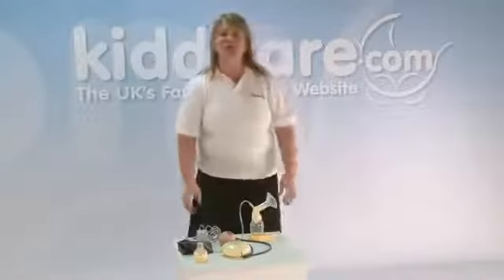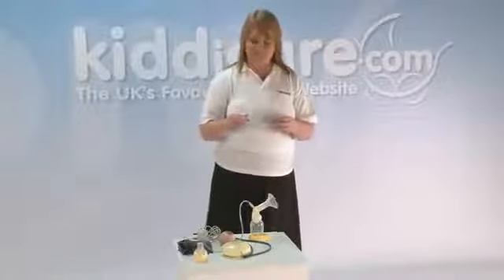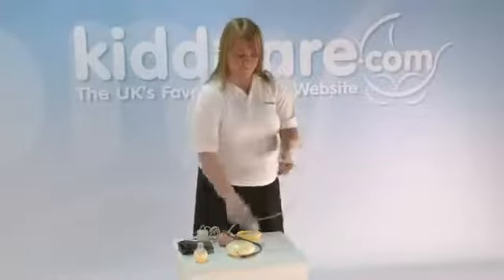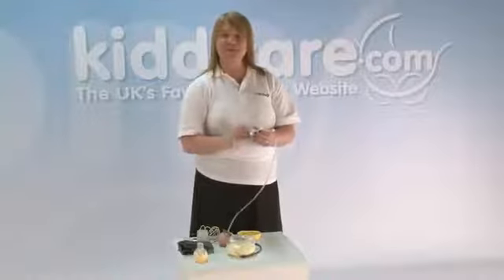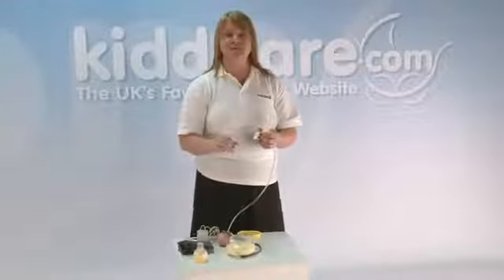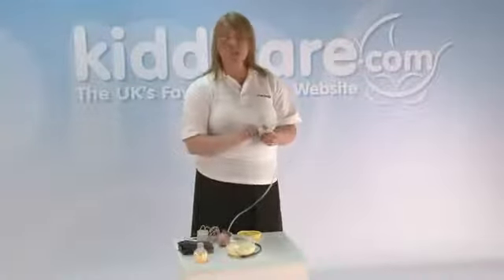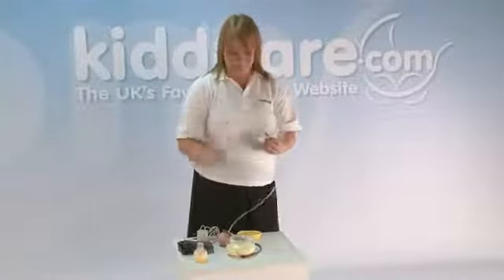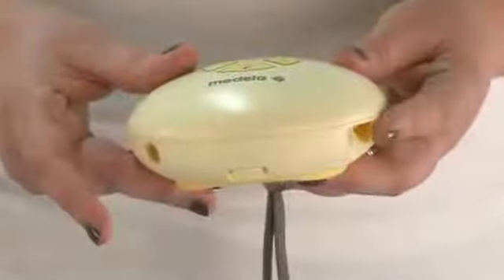So if you're ever using your pump and find the vacuum really not working very well, there are a few things just to check. Firstly, I would check that the white membrane is correctly fitted to the yellow valve. That's really, really important. If the white membrane isn't on, the pump doesn't suck. If it's damaged, the vacuums will be decreased. So you really need to keep an eye on that, and you do get a spare in your box. So check that first and make sure that's on properly, and it's fitting nice and flat to the yellow valve. Check there are no kinks in your tubing and that you've got your tubing in the right hole.